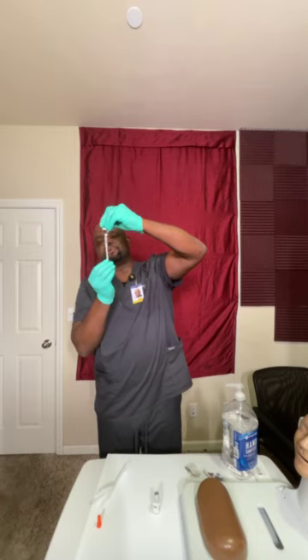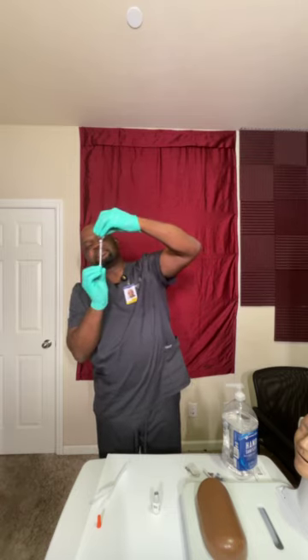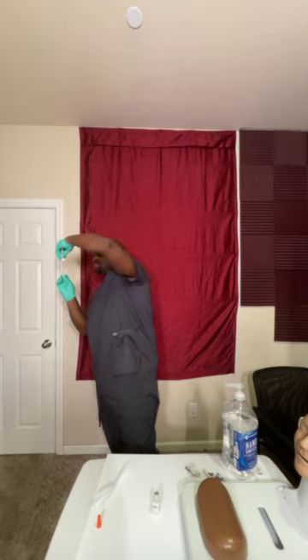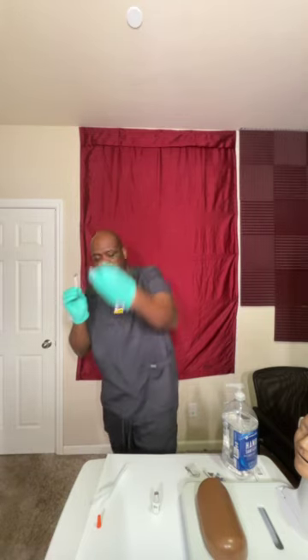Now I'm going to actually pull in 4 units of medication, right? So as I pull in 4 units of medication. Now what's different on this procedure is I'm going to show her first the 4 units of medication. This is for the regular insulin, 4 units of regular insulin. We're going to pull this out of the bottle. And we're going to tap on it to make sure that there are no bubbles. Good, there are no bubbles in there.